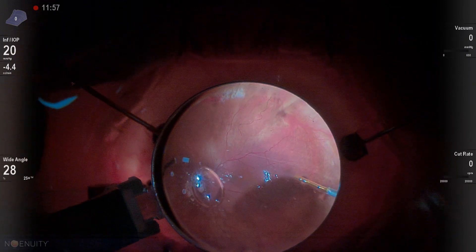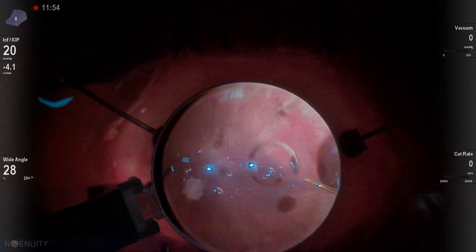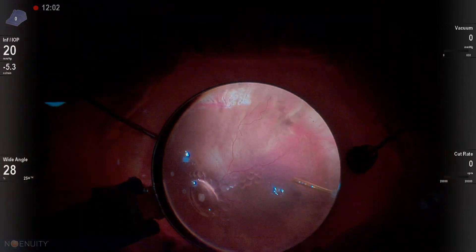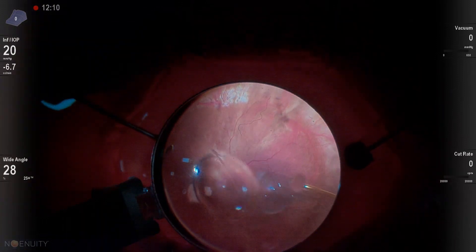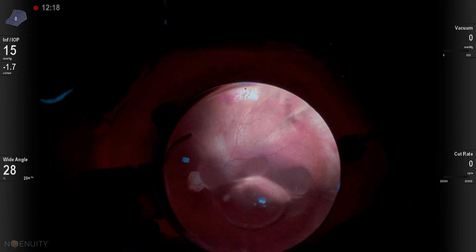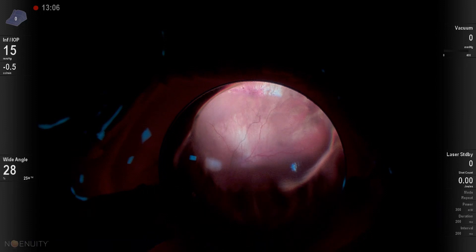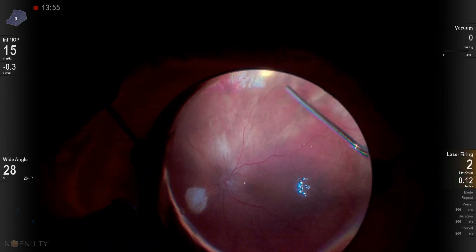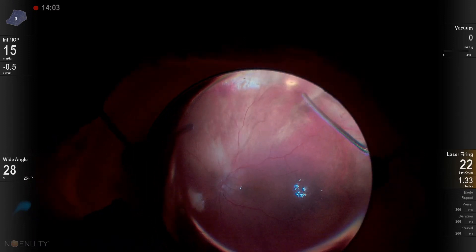Here we can see we get a few air bubbles and a few PFO bubbles, but those will coalesce. Keeping that pressure down to 20, and utilizing the dual-bore cannula where we keep the outer bore in the fluid so that we're allowed to evacuate fluid from the eye so the pressure doesn't go up too much. Now we're going to start our laser in this patient's eye, lasering inferiorly where we still find there's some trapped subretinal fluid anteriorly.